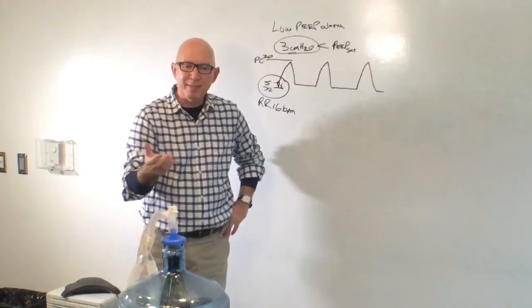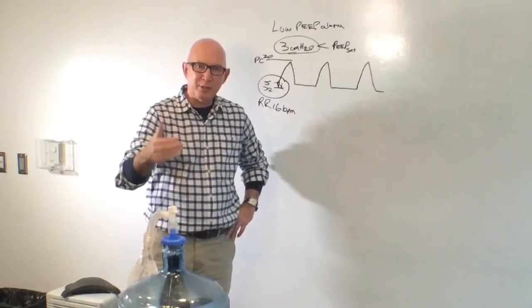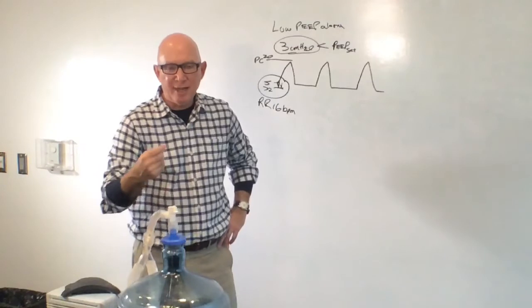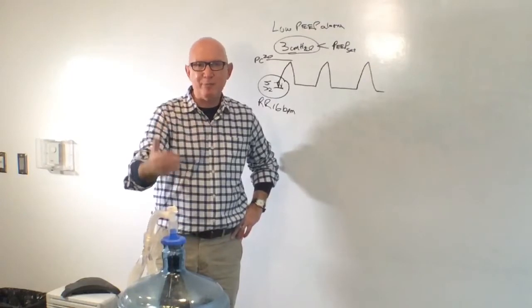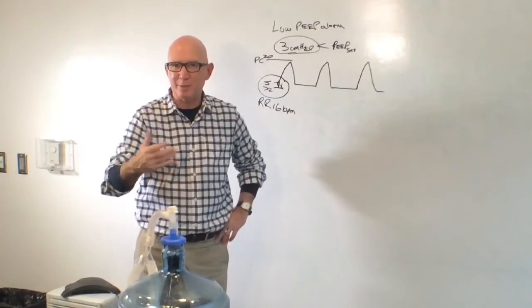And the point of it was that there were a number of events where alarms should have been triggered that weren't triggered, and patients had an adverse event as a result, because patients in a post-anesthetic care unit have blunted chemoreceptors to hypoxemia. As a result, they can have a hypoxemic event, but they don't increase their alveolar ventilation the way you or I would if we had the same sort of thing happening.